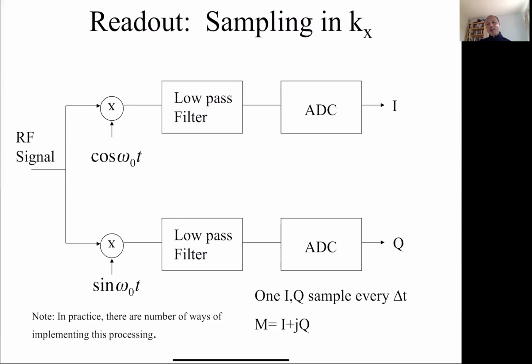Now, in your upcoming homework assignment, you're going to be given some other trajectories. You still want to apply those basic concepts. But one warning: don't try to apply the specifics of what we're doing right here for the spin warp pulse sequence to those other pulse sequences, because that won't work. That is something that people try to do.